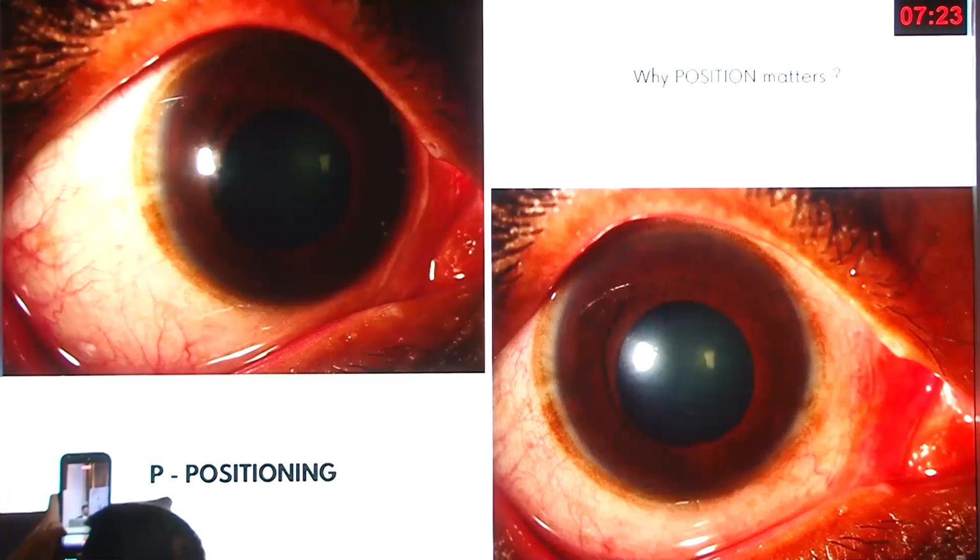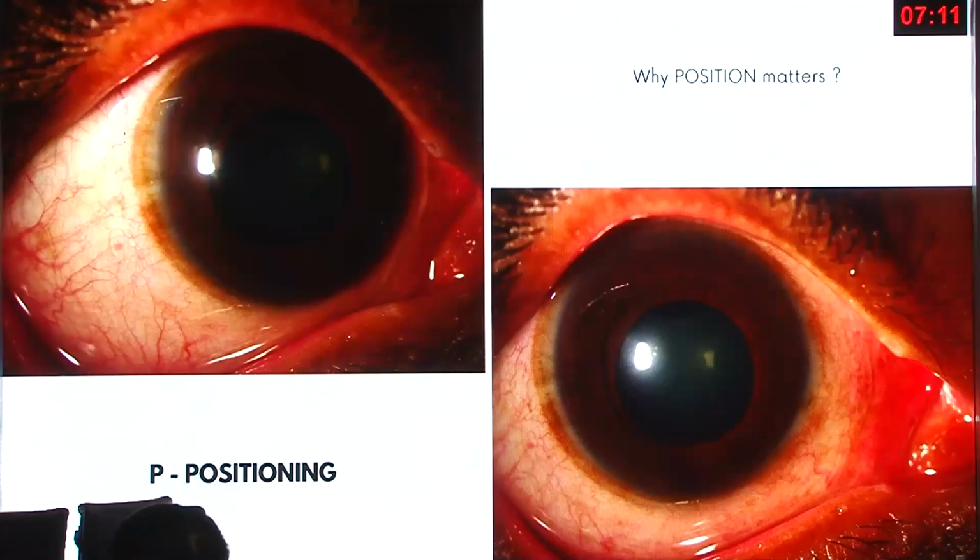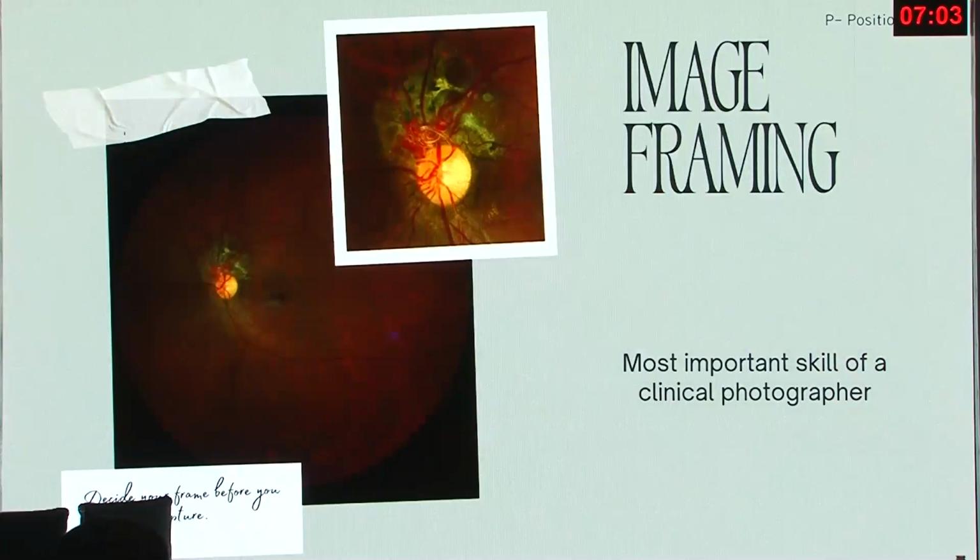So why does position matter? In the first image on the left, you can see the patient is looking nasally, and hence the area that we wanted to photograph has not come clearly in the picture. When the patient is given a fixation light and asked to look straight, that is when you can capture a very good image with good illumination. So positioning definitely matters. And also something further in positioning is framing.